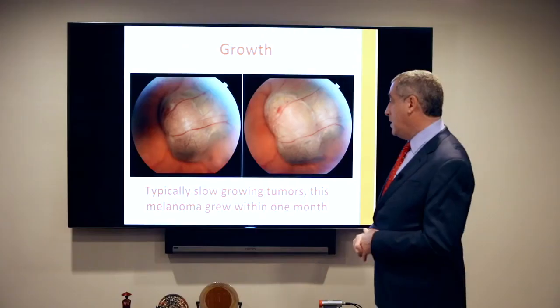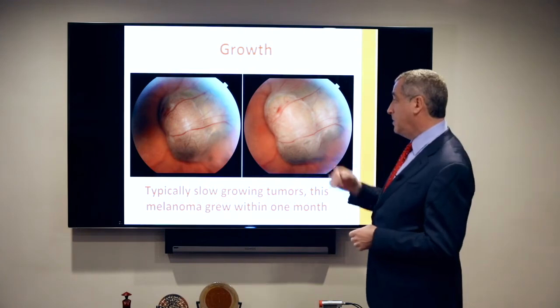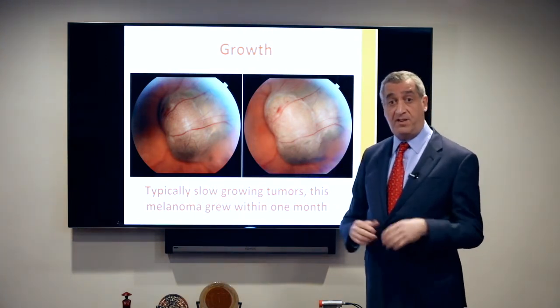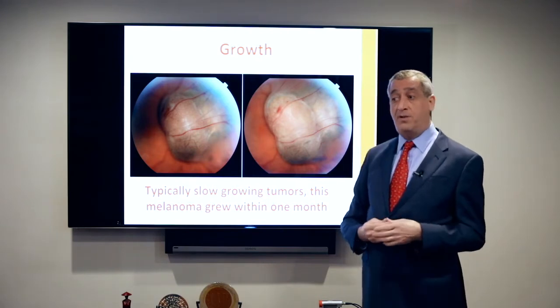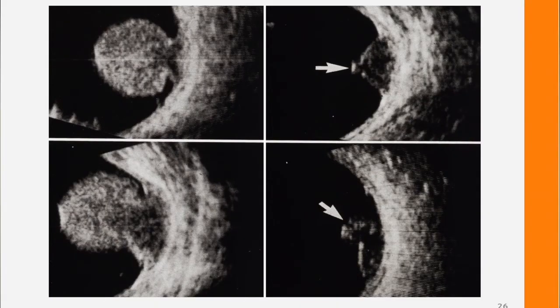But typically melanomas are slow growing. This particular tumor that we just saw grew this much in a month. And as I said, growth is perhaps the most important finding in diagnosing a melanoma.